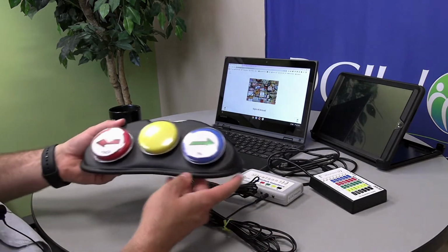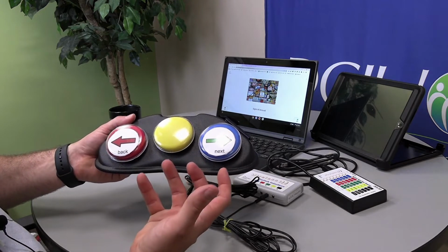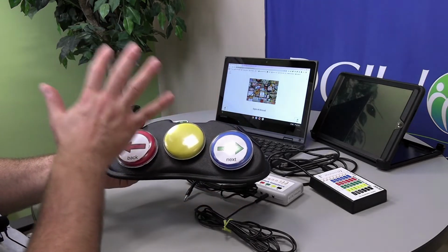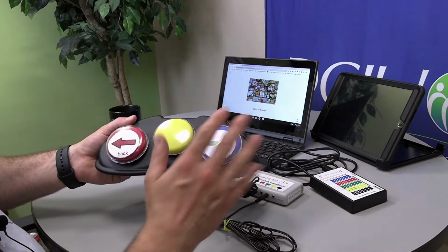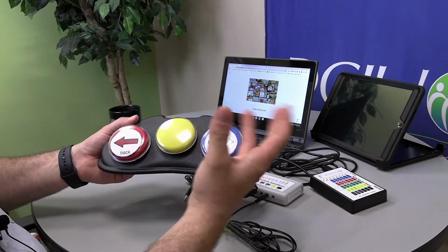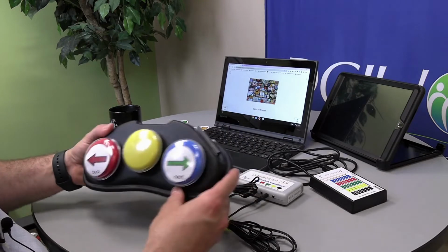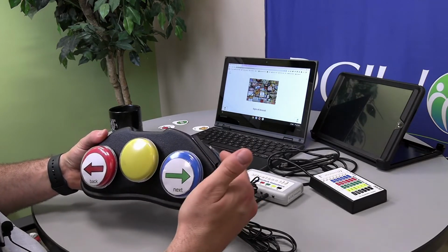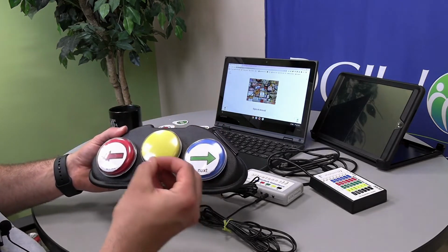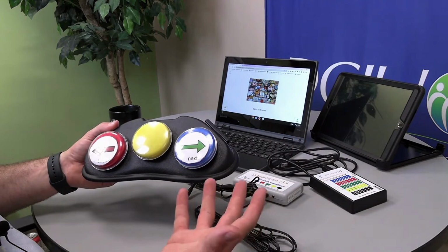And then finally, we have a 3-button mid-tech speech output device, which we've labeled here with a back and next to correspond with the activity. When we connect this, a student can press next and it will take them to the next page. Same thing with the back button. What's nice about this too is that as a mid-tech device, you could record your voice, turn down the volume on the story, and the student would be able to hear that core vocabulary word expressed. Other adults in the room or other students would be able to hear it as well.